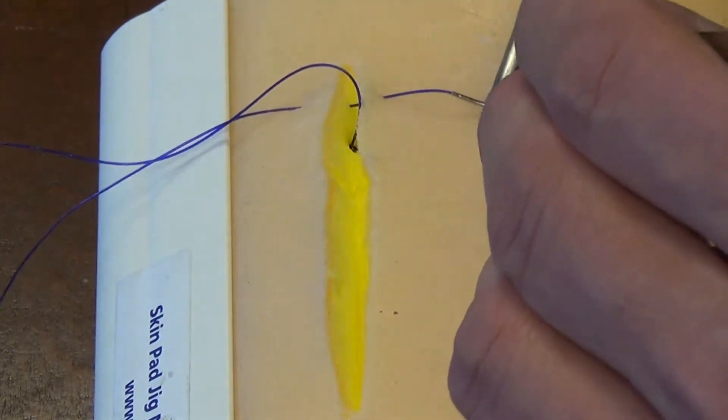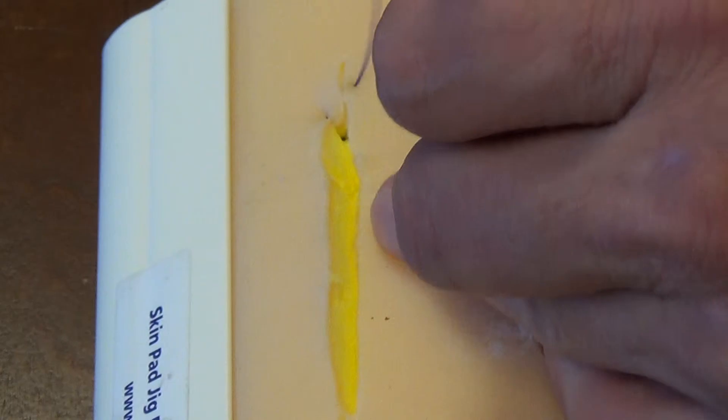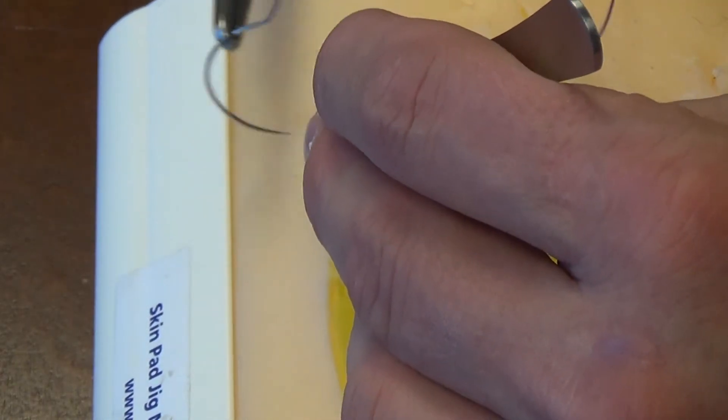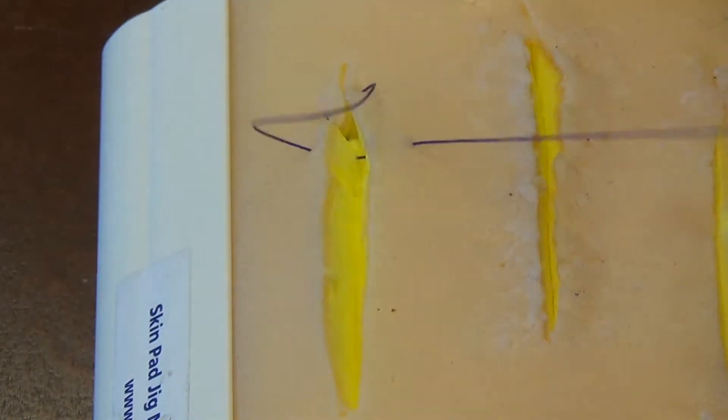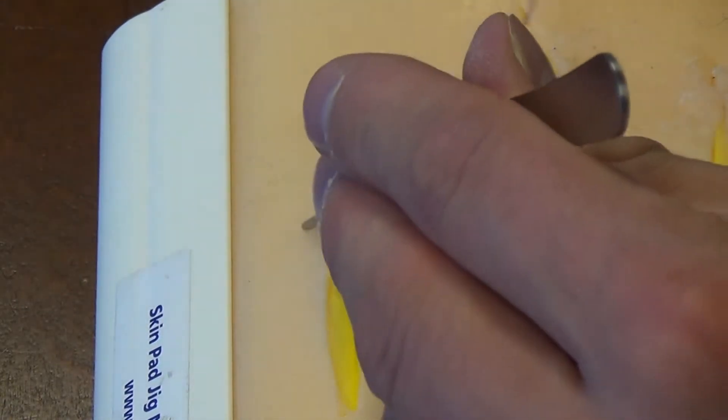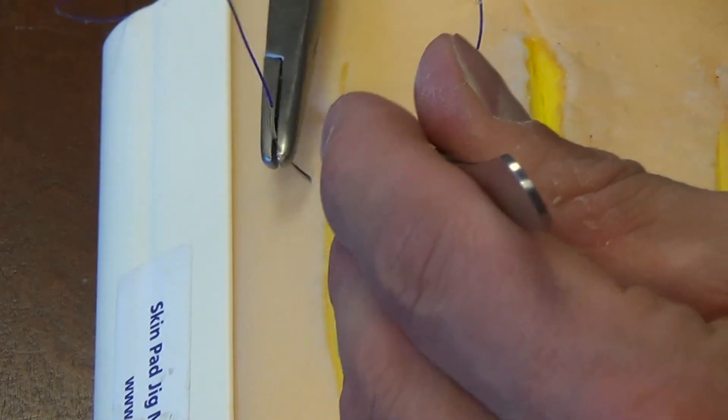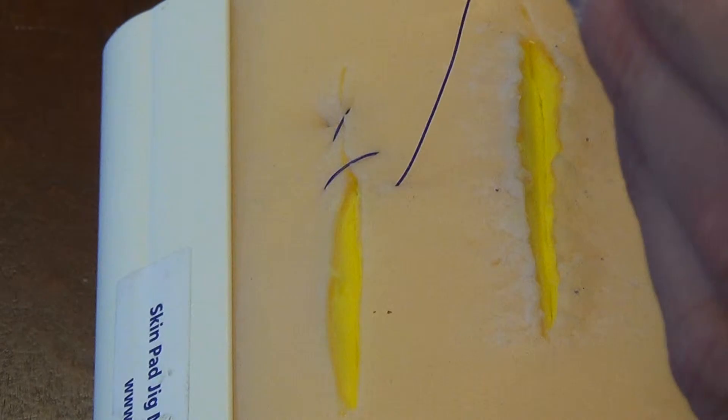Now essentially, whether you start on this side or this side, you're really just looking to gain purchase with that variable loop. Now you're running in a simple running fashion, unidirectionally from that variable loop.